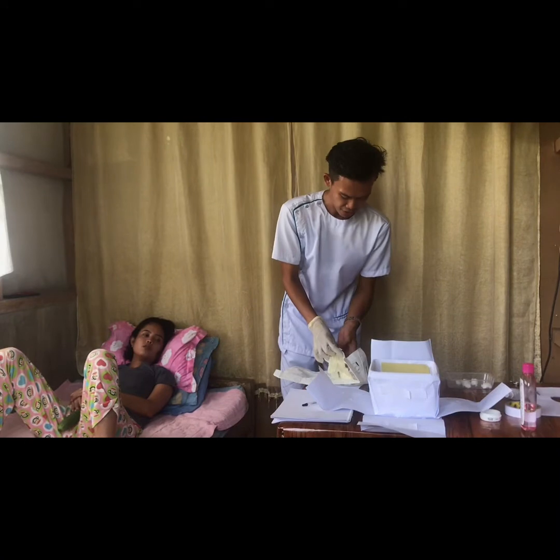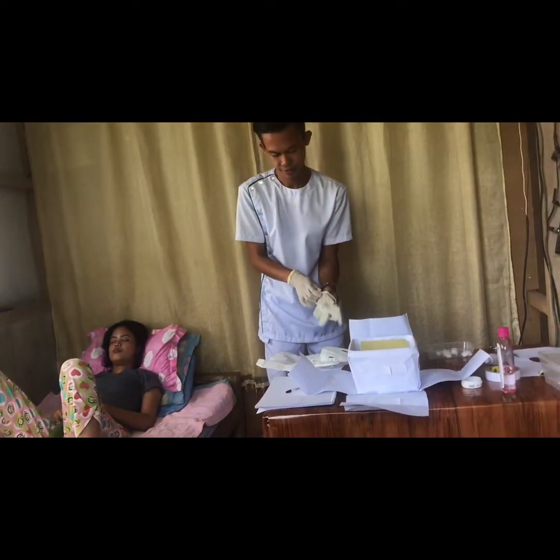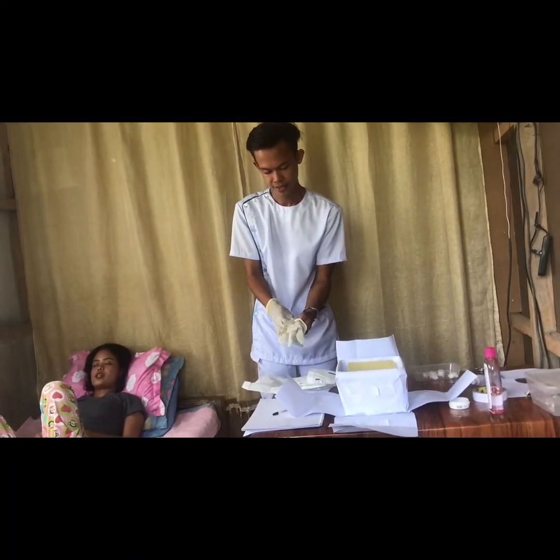How's it going, sir? Are you okay? Yes, I'm fine. You're having the catheterization. Are you ready? Yes, I'm ready.